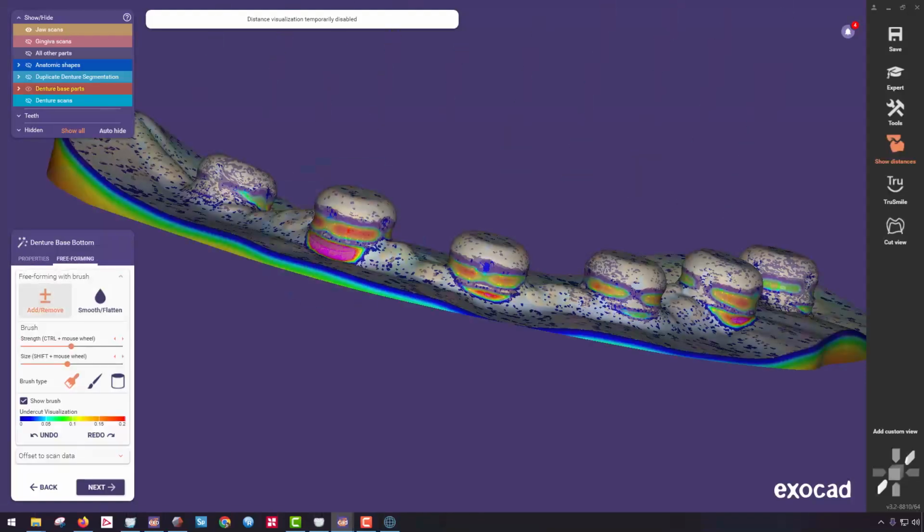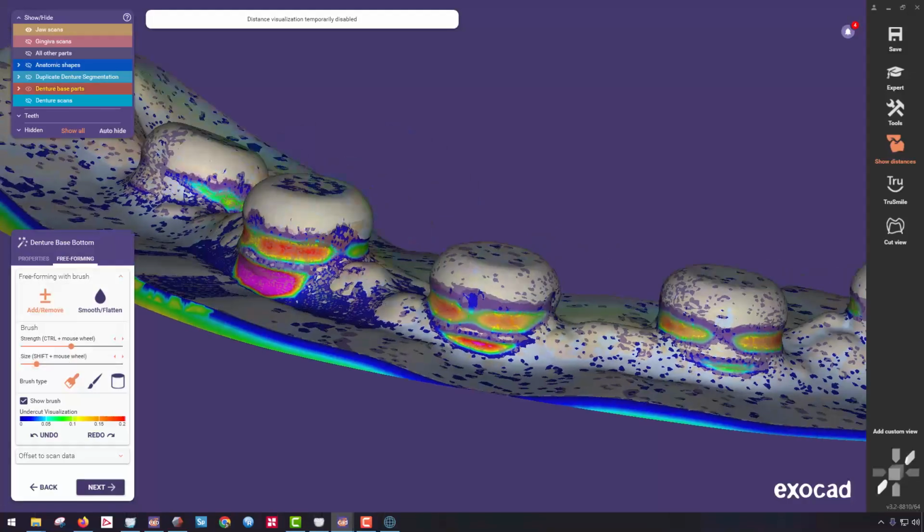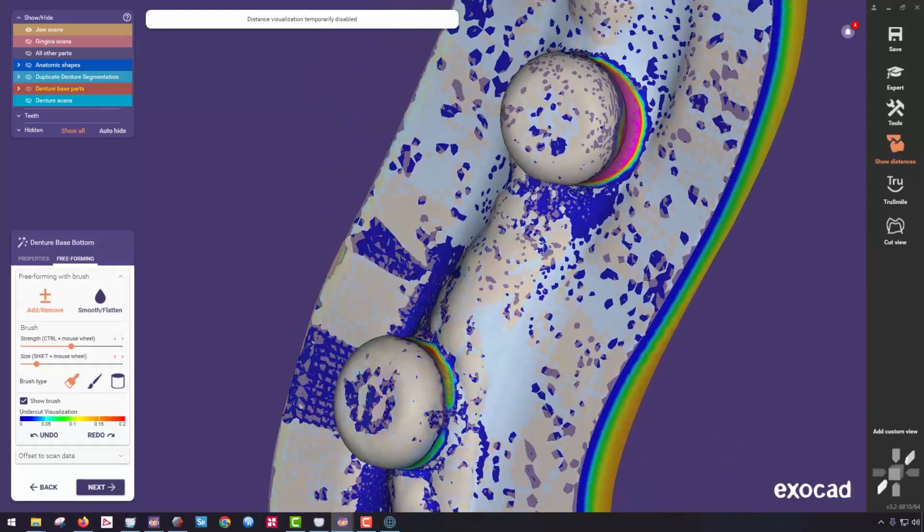Click on freeforming, and then I want to get rid of any of that block out that it's doing right in here. I want to get rid of any of that block out around my scan body geometry.